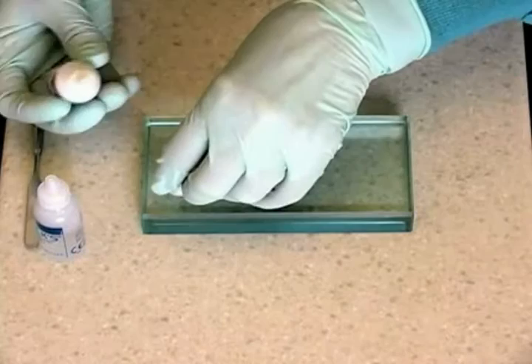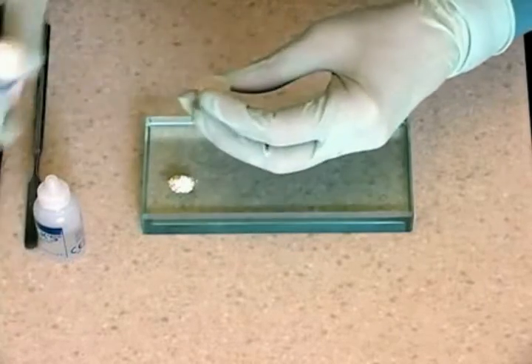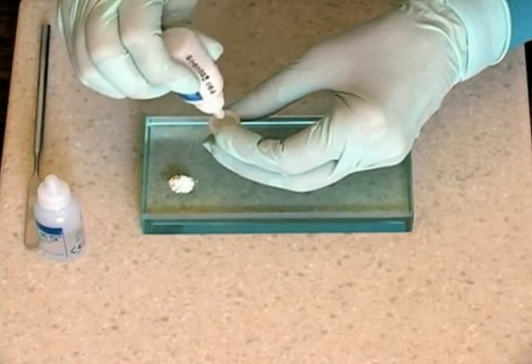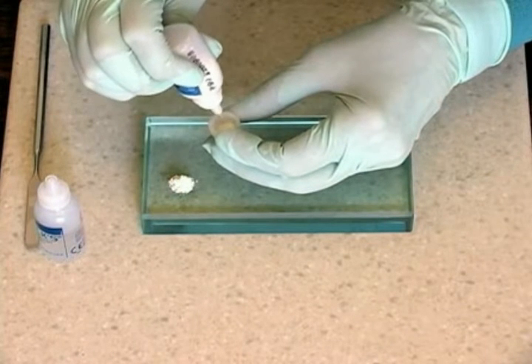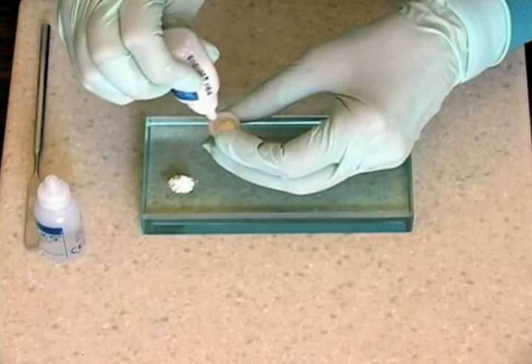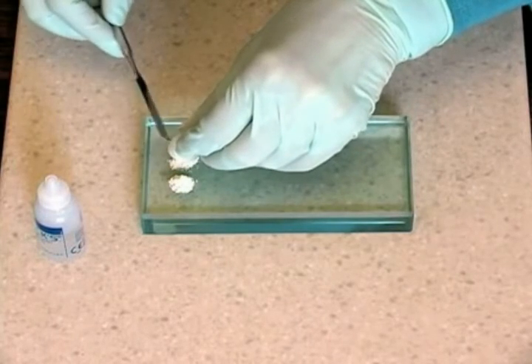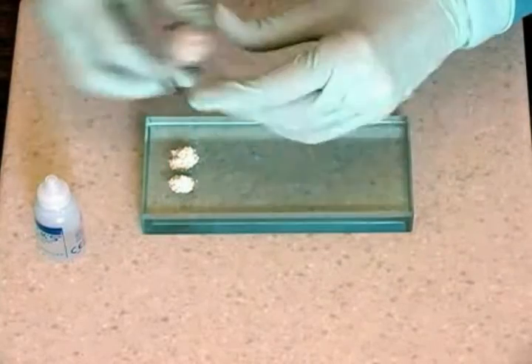Place two powder measures on the right-hand side of a cool glass slab. Use the spatula to ensure all the powder is dispensed from the cap. Replace the cap on the powder bottle.